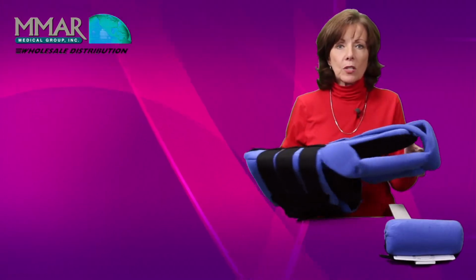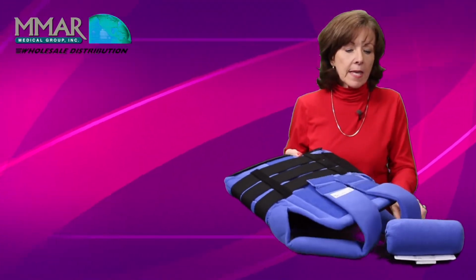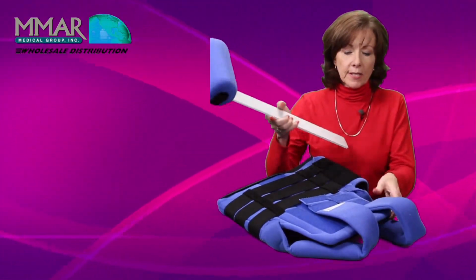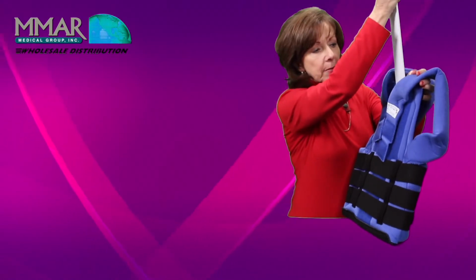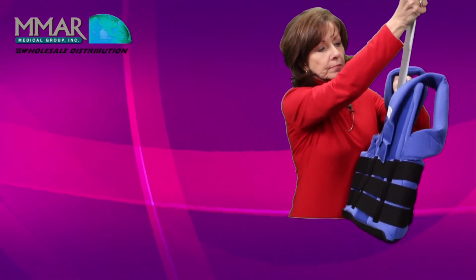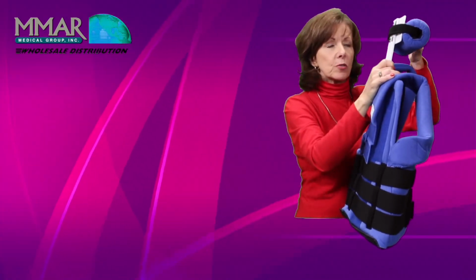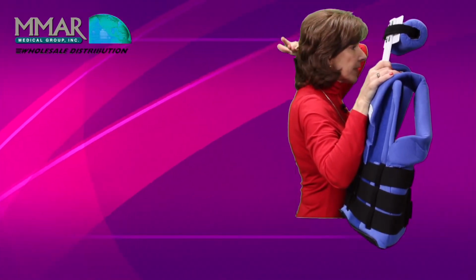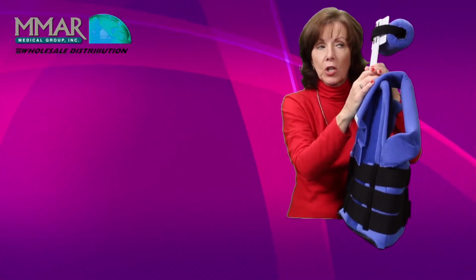So for that, we use the Vertebrese TLSO, and we've already put it on them. Then we add the Hyperextension Stop, and it simply slides down in the back of the device. And this goes wherever on the back of the head you find that it does the most efficient job.